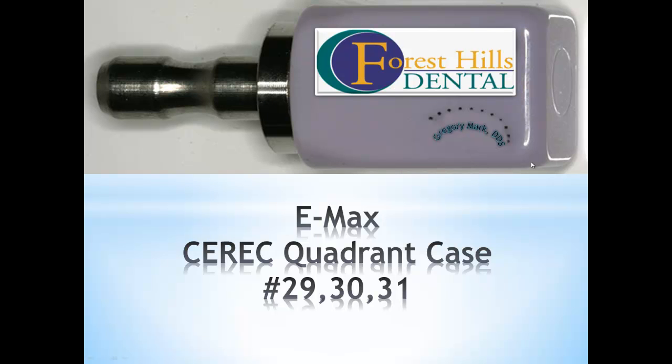Today we're going to discuss a quadrant case. We'll prep cases number 29, 30, and 31 in one session. But I also want to show you and share with you my mistakes, and how I approached this case.